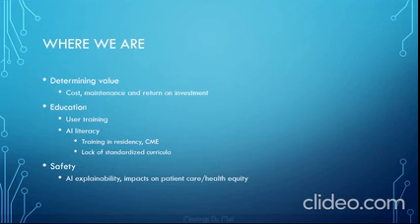AI explainability is a feature of AI applications that allows the human users, in this case the radiologist and the ordering provider, to understand what part of the imaging exam led the AI to make its decision. This can effectively allow a radiologist to recognize false positives and false negatives when they occur, and override the AI results when necessary.